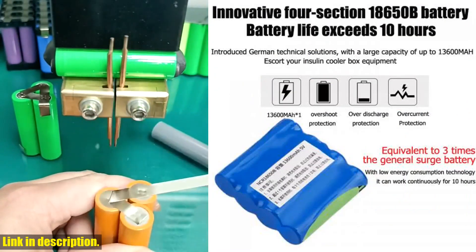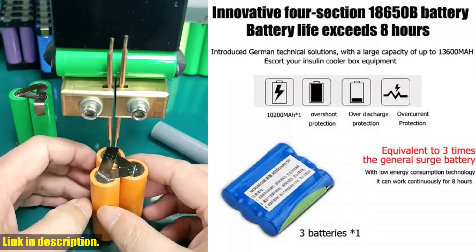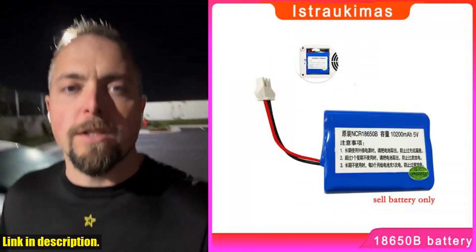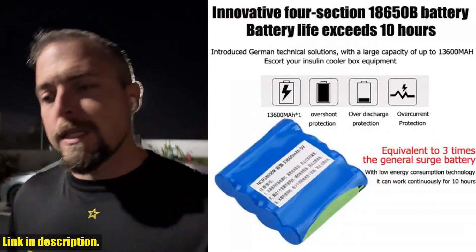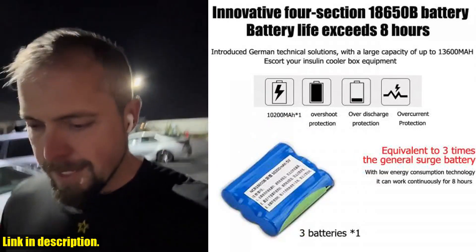Let's talk about why this lithium battery is an absolute must-have for anyone who relies on keeping their insulin refrigerated. With its German technical solutions and a whopping capacity of up to 13600mAh, this battery will be your ultimate companion for your insulin cooler box equipment. One of the most impressive features is its innovative 4-section 18650B battery, which ensures a battery life of over 10 hours.